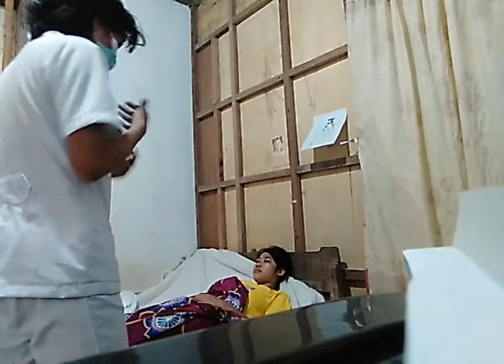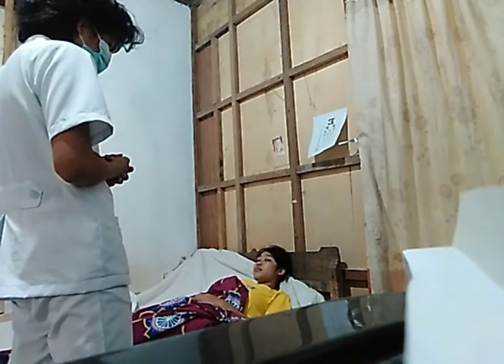So good morning, sir. I'm Ronald Paulo Martin, and I will be your nurse for today. So sir, may I know your name, please? Angelo. Okay. So today, sir, I will be inserting a catheter on your private area.